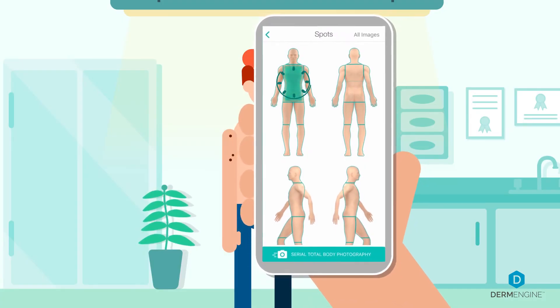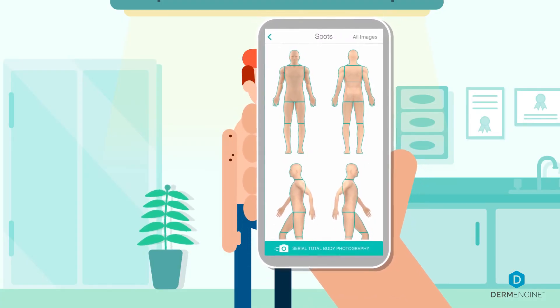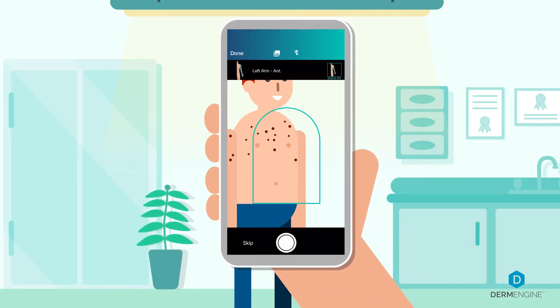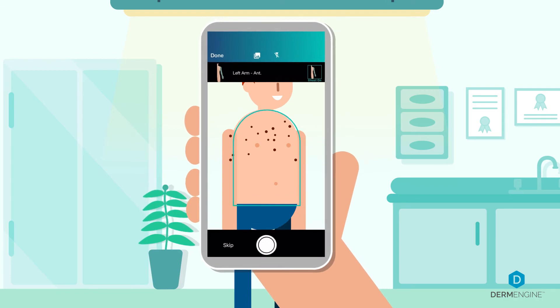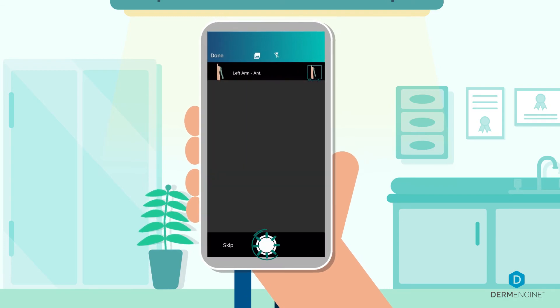Alternatively, if you wish to only take images of specific body parts, simply select that body part from the digital body map.